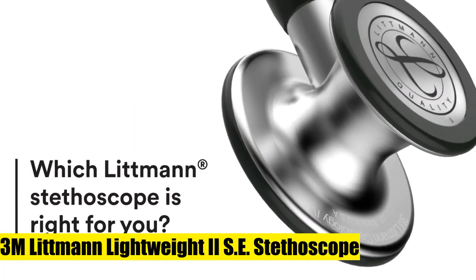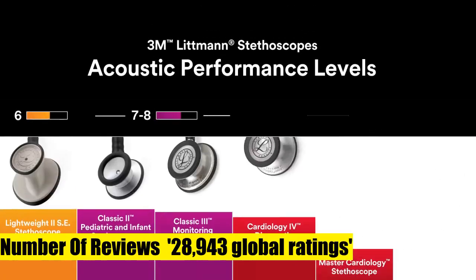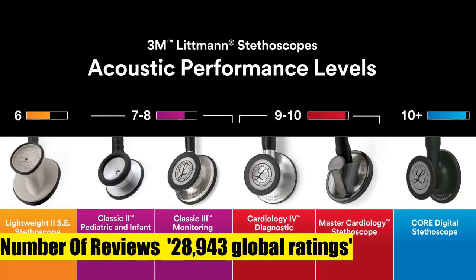3M Littmann Lightweight 2SE Stethoscope, Caribbean Blue Tube, 28-inch. Lightest weight of all Littmann adult stethoscopes at just 118 grams.